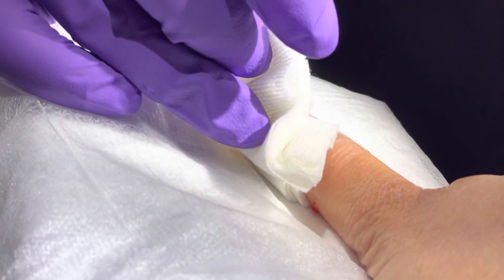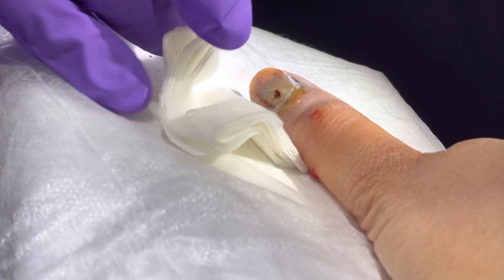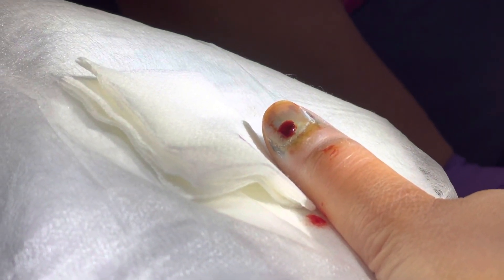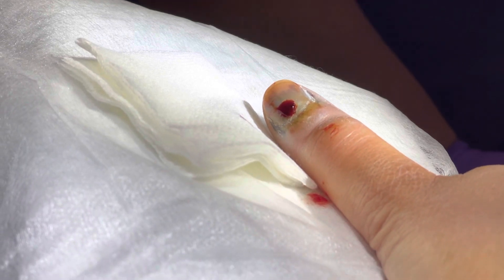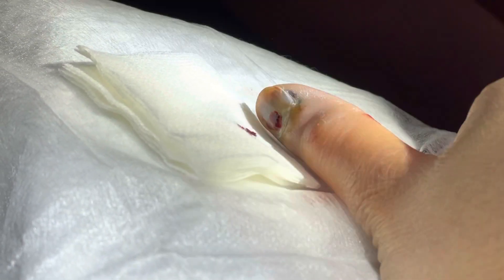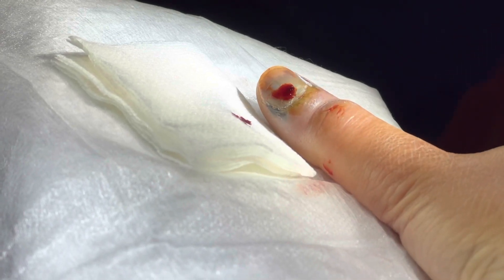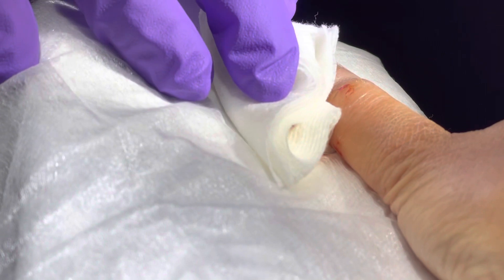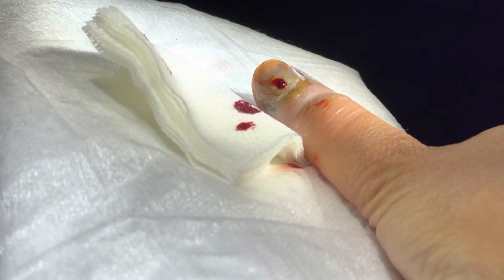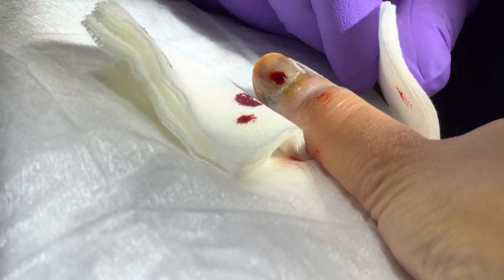It looks like it's just going to pop out — so much pressure in there. So we say: see one, do one, teach one, then write a book. You've seen a digital block, so the next time someone needs a digital block, you say 'I've seen one, so I'm ready to do one.' You've done a few digital blocks too, haven't you? Yeah, I feel okay, I'll get it.